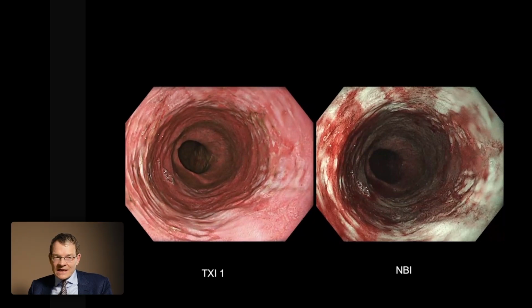What is very interesting with TXI is that bile reflux or acid reflux doesn't disturb you that much. So in case you have such a severe reflux esophagitis, I think TXI is quite helpful to use in order to detect if there is something wrong somewhere.